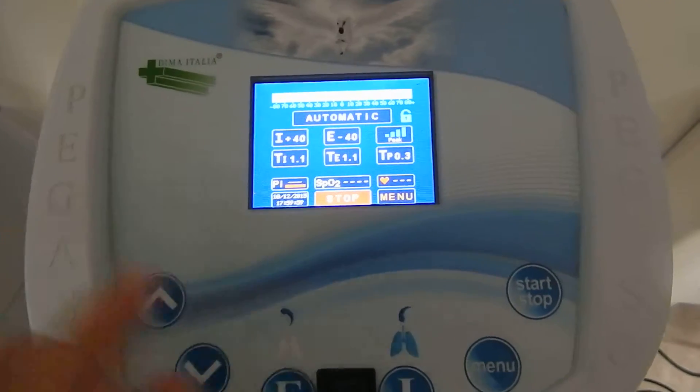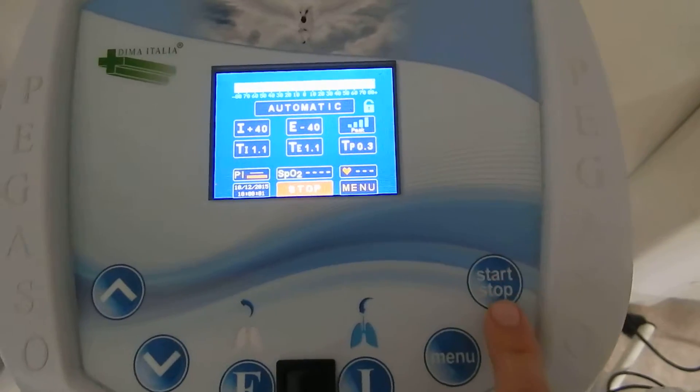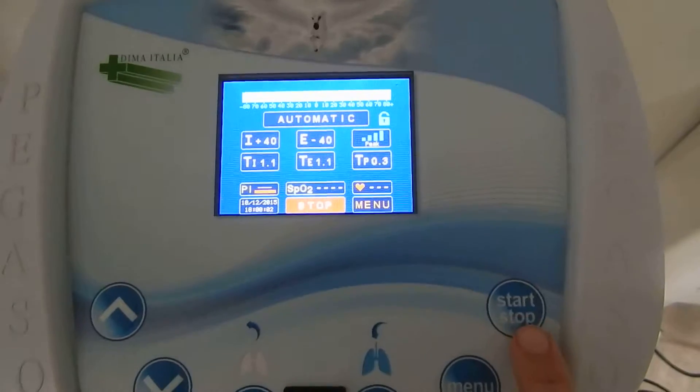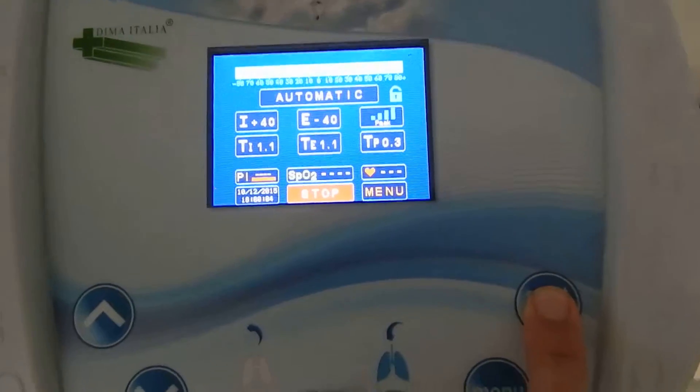To start the therapy, it is enough to press Start and hold it for two seconds.